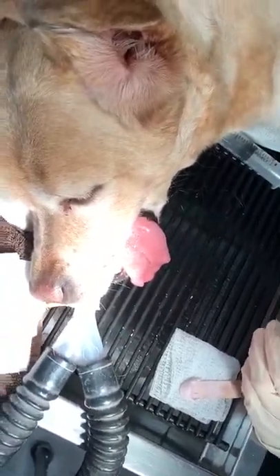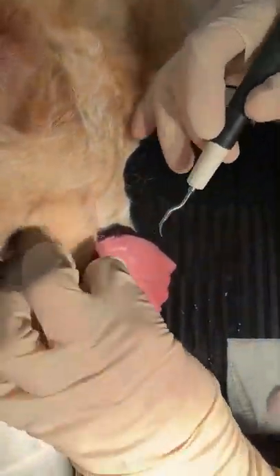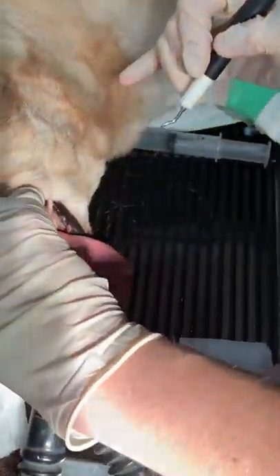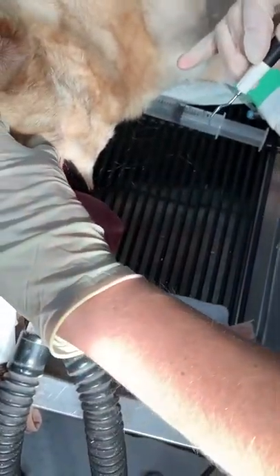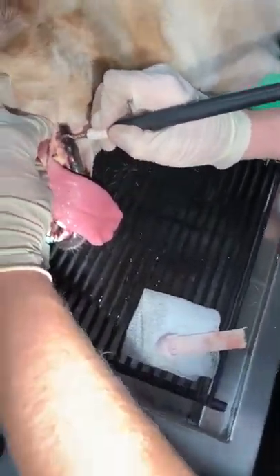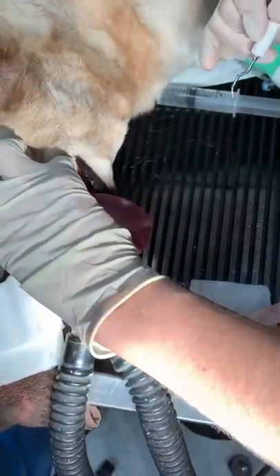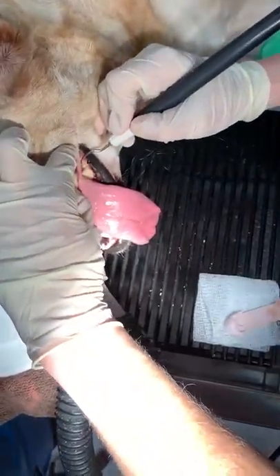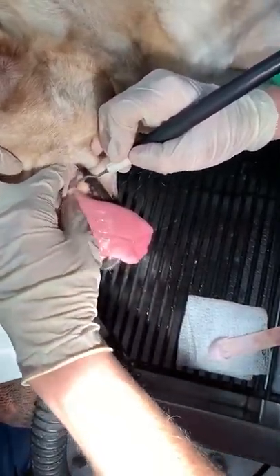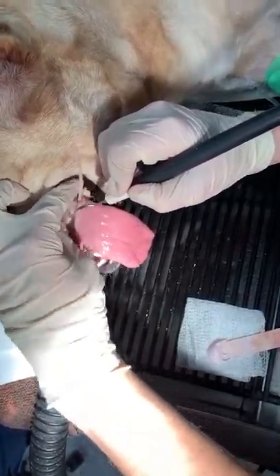All right, so assuming I've polished all the teeth on this side, I'm going to rinse. We're going to come back with the scaler and rinse off the polish. There would also sometimes be fluoride as well, but I'm not going to demonstrate that at this point — I'm just going to use the scaler to rinse.